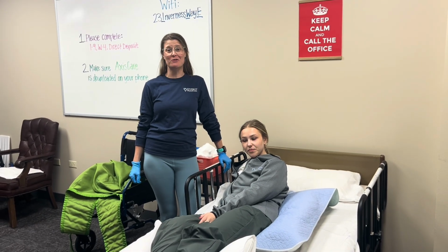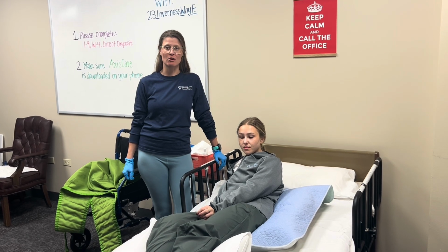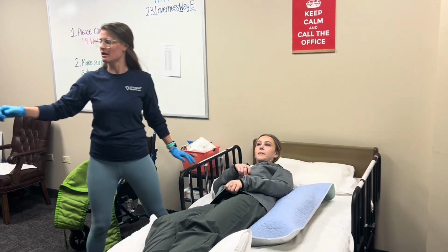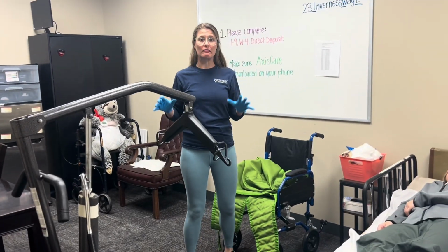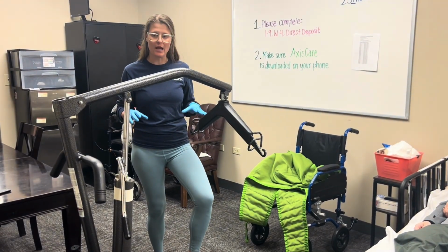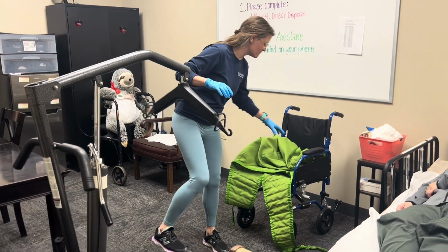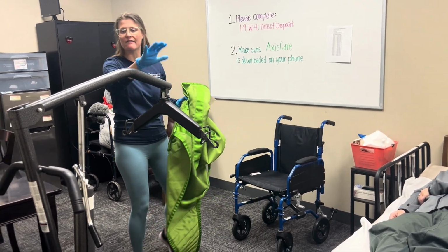And today we're going to teach you how to use a Hoyer lift for our clients that are either bed-bound or dependent on their mobility. So first, when we are learning about Hoyers, we have to have a Hoyer. All Hoyers are a little bit different. So make sure that you're familiar with the Hoyer lift that your client is using. All Hoyers have similar things. We have a sling and we have the device.